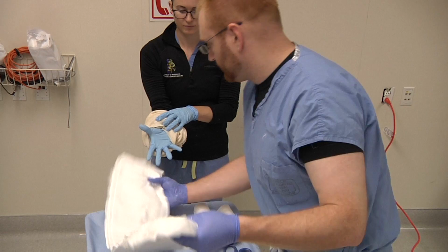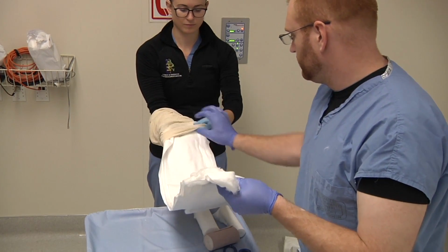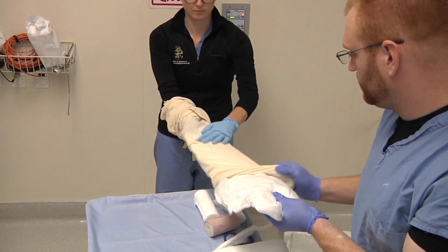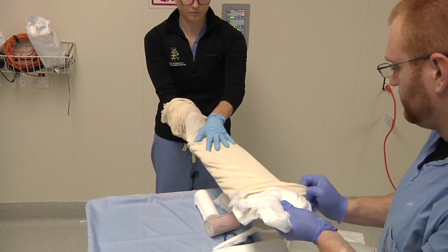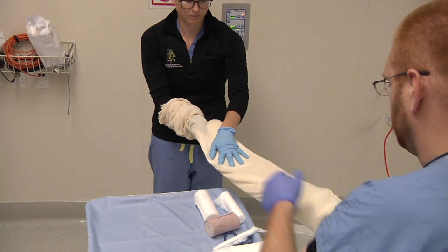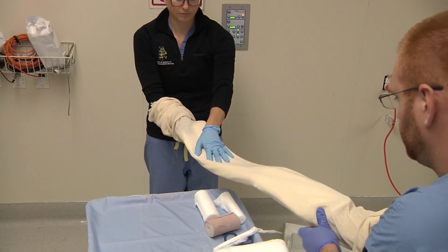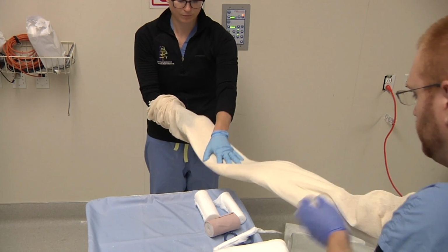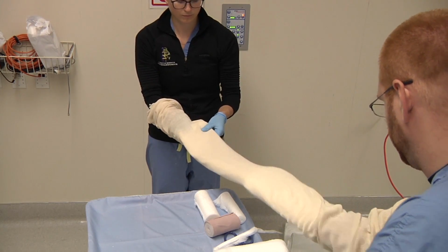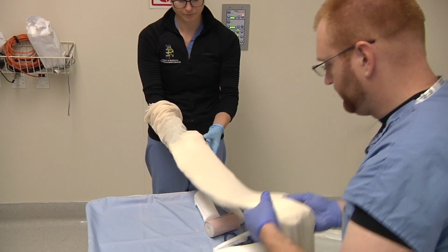We're going to take our web roll plaster burrito and gently, to keep it from rolling, put it generally in the middle of our 6-inch tubular bias. So you feel you've got an adequate amount. Make sure it's still flat and well padded.